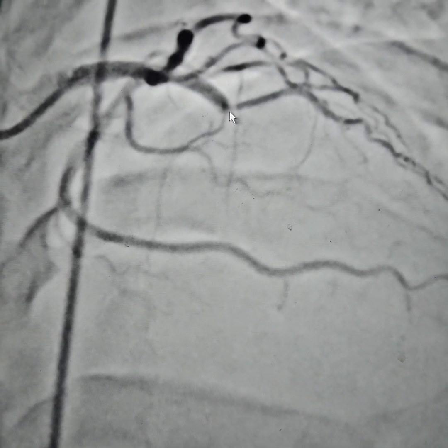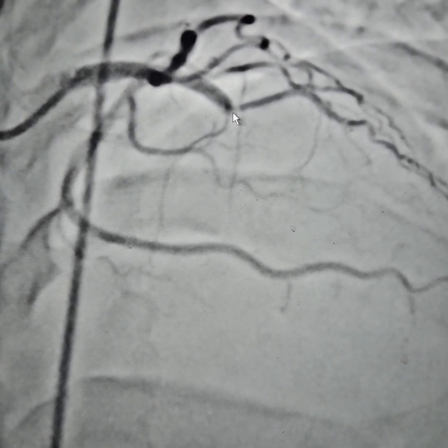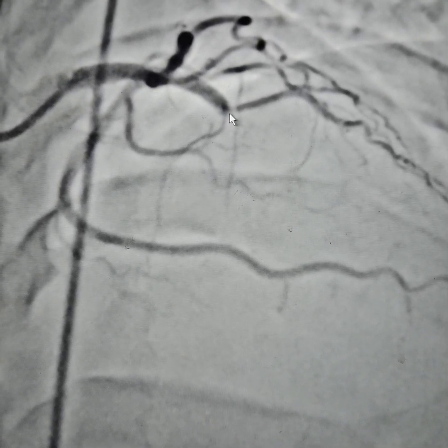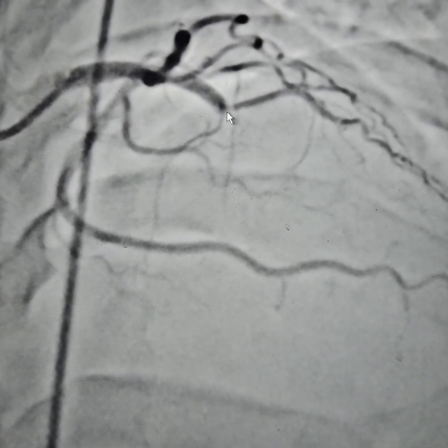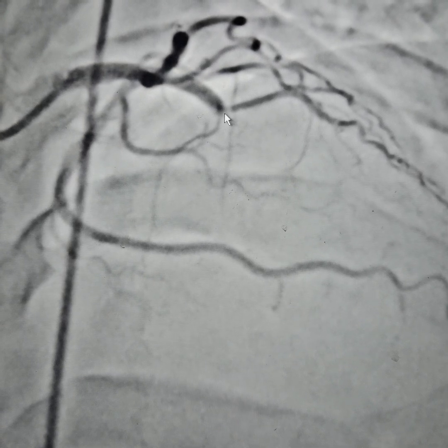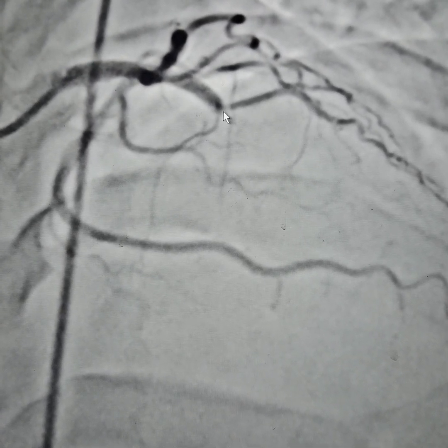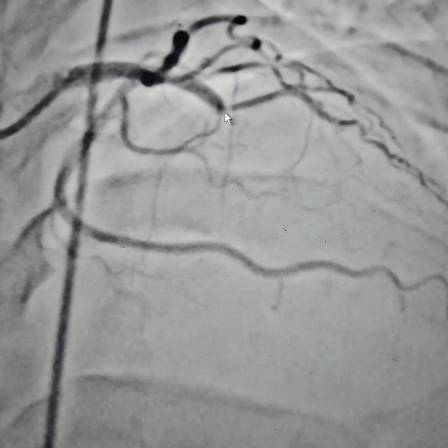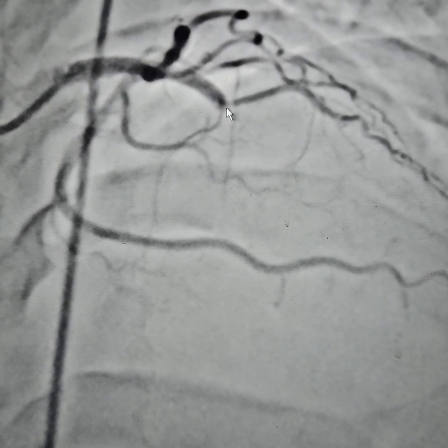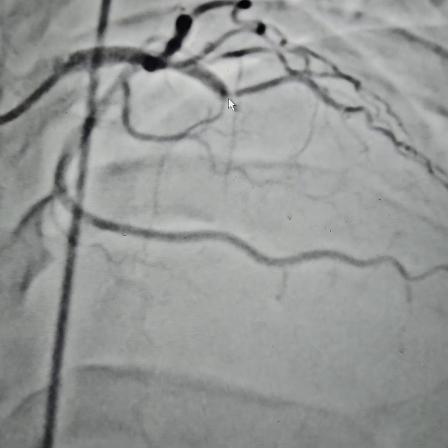The patient presented in heart failure. We stabilized the patient with LV failure management. The patient also had a left bundle branch block. Because of the LV failure and mild angina, we had to proceed with angiography.